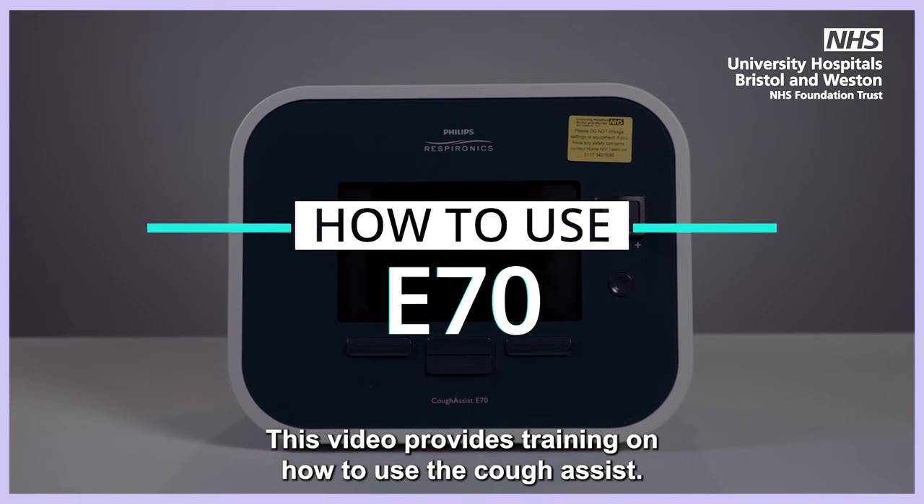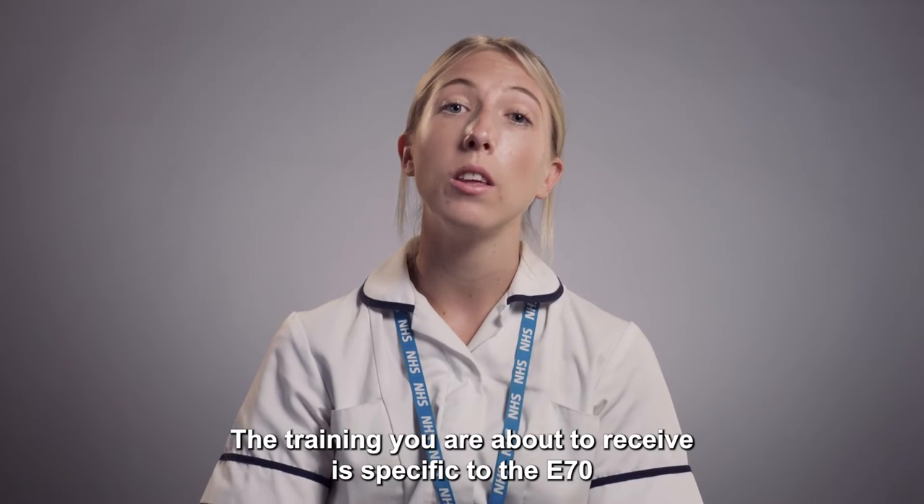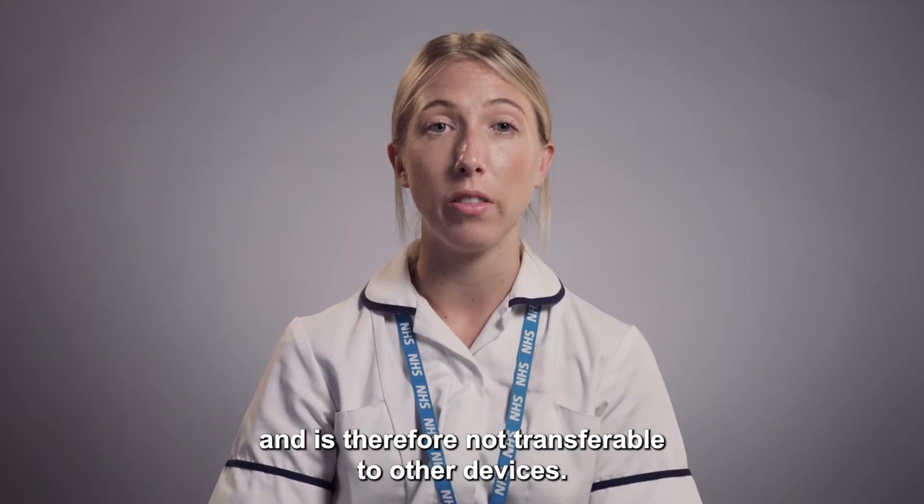E70. This video provides training on how to use the Cough Assist. The training you are about to receive is specific to the E70 and is therefore not transferable to other devices.